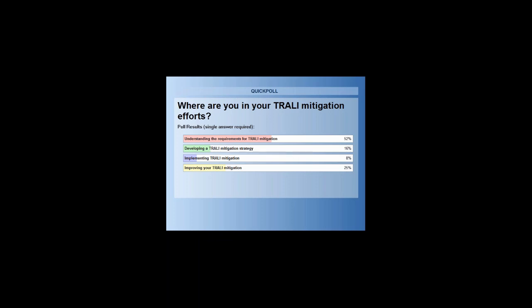And for HNA2, we need to carry out further studies. It may be that the ratio can be set even higher than 20, because there are many background reactions by the bead HNA2, especially by using a specific sera.